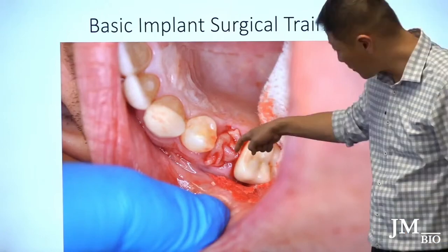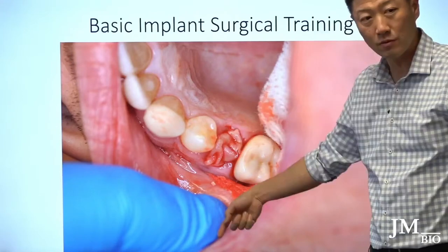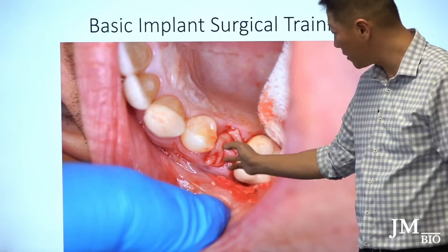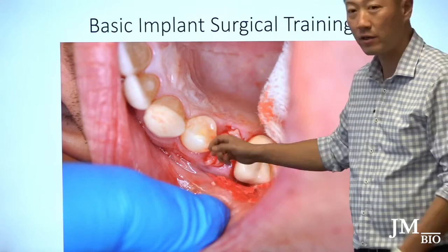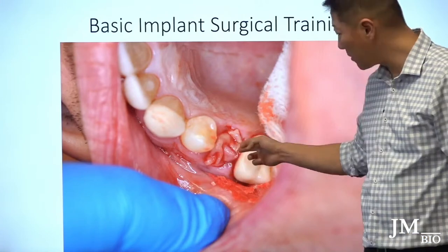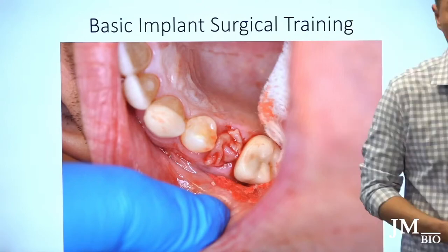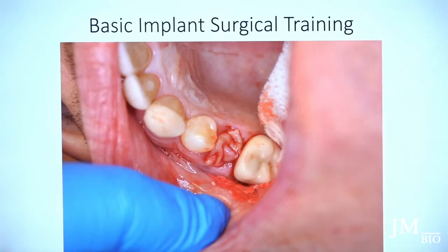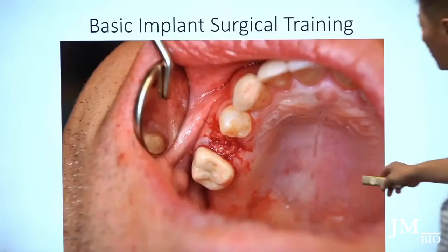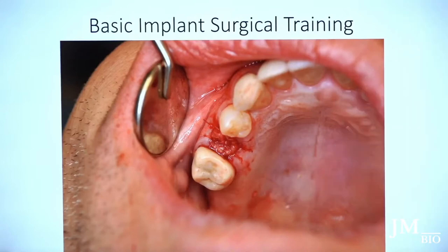For the modified figure-eight, I grab the membrane and the mesial tissue and loop around. Normally a figure-eight goes from here to here then ties, but instead I extend the path to incorporate the membrane tacking. Then I placed one more suture in the middle to stabilize the membrane. This tacks the membrane into the socket and creates a seal.